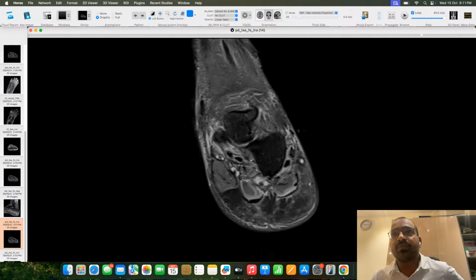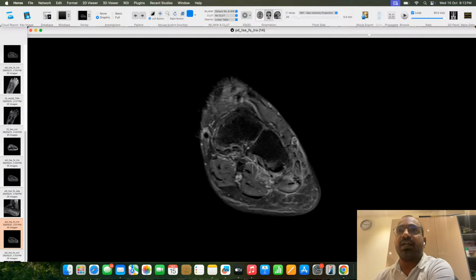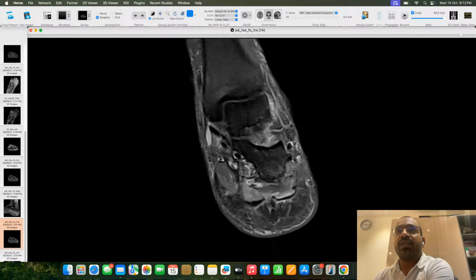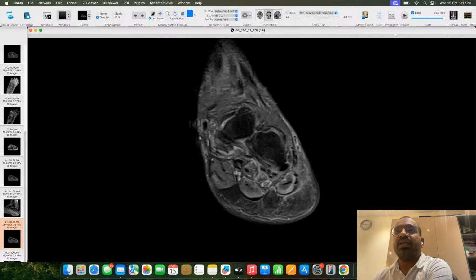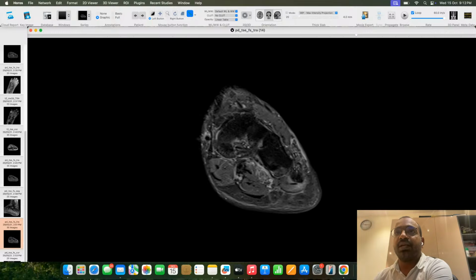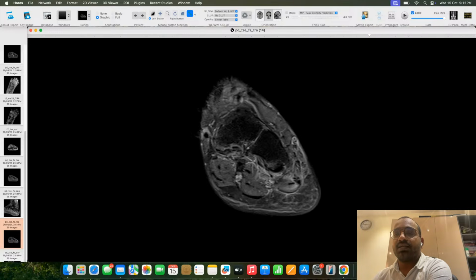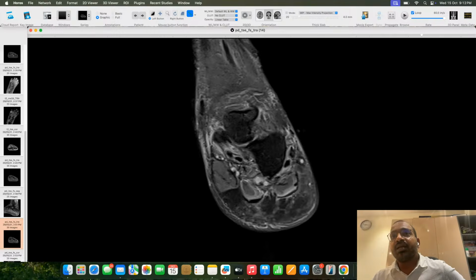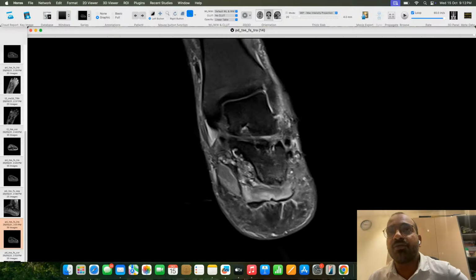If you see the lateral aspect of the foot and ankle region, if a patient complains of pain, especially in the plantar aspect, if you see here, this tendon which is down, this is a peroneus longus tendon. This is a peroneus brevis tendon. In peroneal tenosynovitis, or peroneal tendon like peroneus brevis or longus interstitial tears, the patient does have pain, and it can be a pain of peroneus tendon or even this lateral band of plantar fascia tears.